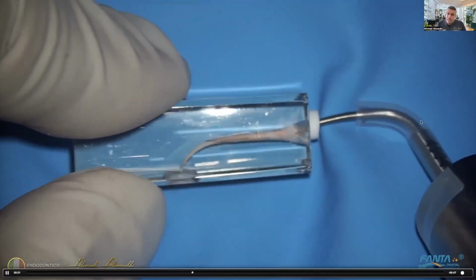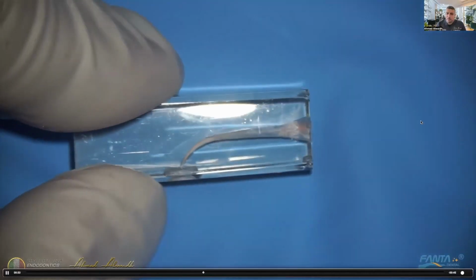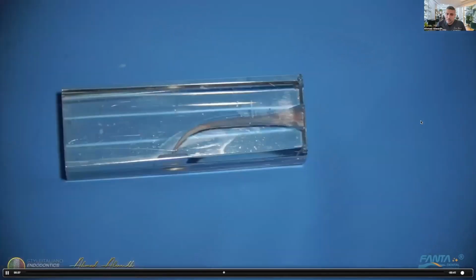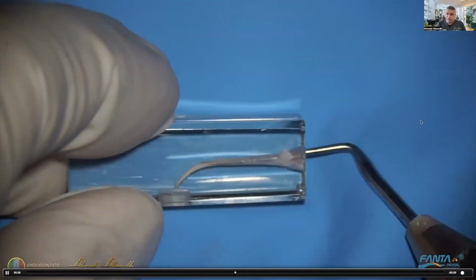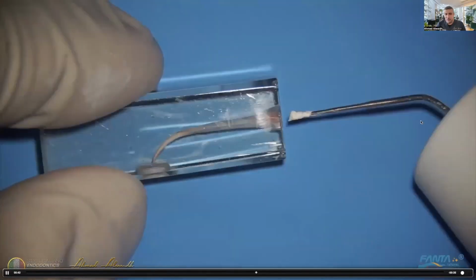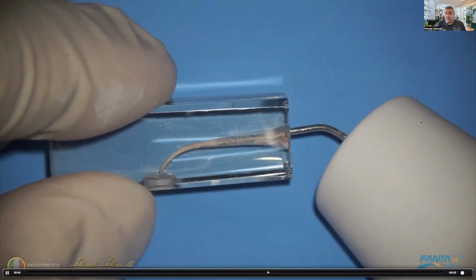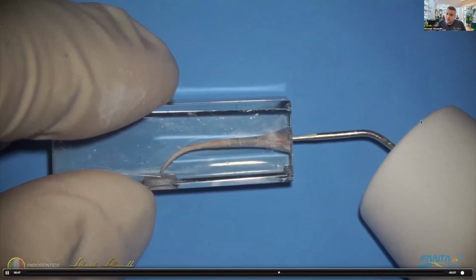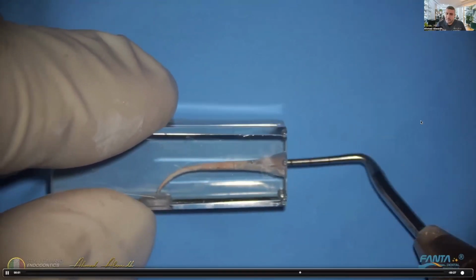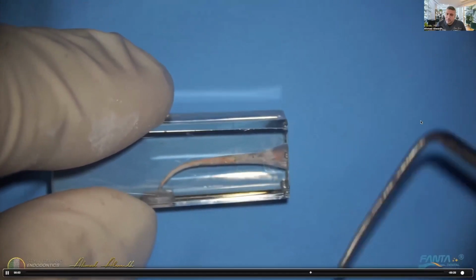Then this is the down packing of gutta-percha. Then we bring our cold plugger to compact the gutta-percha. Now we have the apical third, which is three-dimensionally obturated. Then we insert the E-filler. Also, we need to put a small amount of the sealer on the tip. Now, this is the middle third.